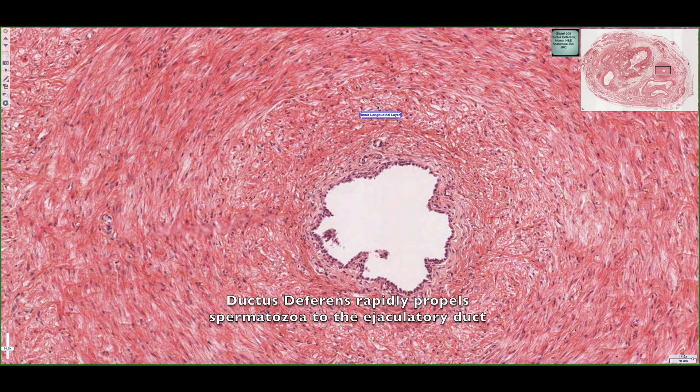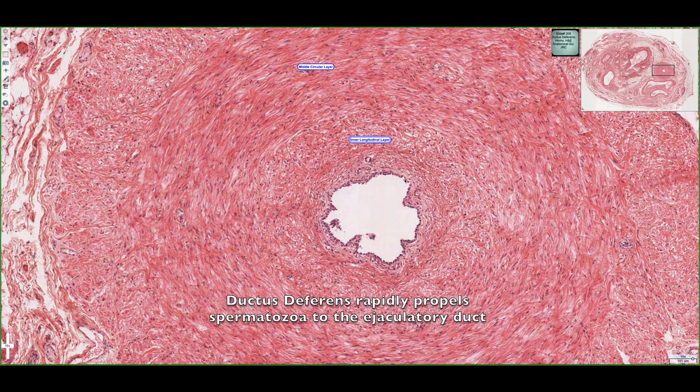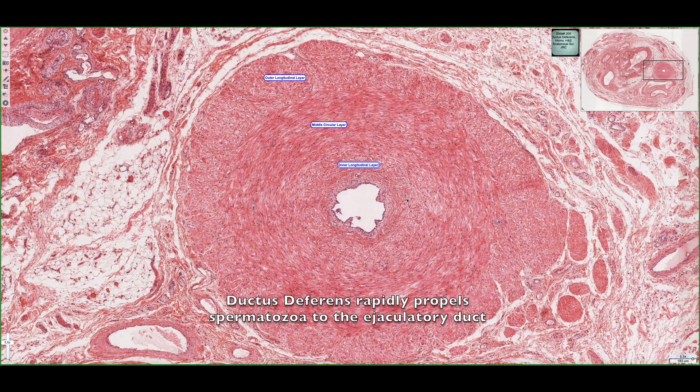Functionally, the muscle layers that surround this duct allow for rapid propulsion of the sperm that has been developing in the tail of the epididymis towards the ejaculatory duct, where it's going to mix with secretions from the seminal vesicles.